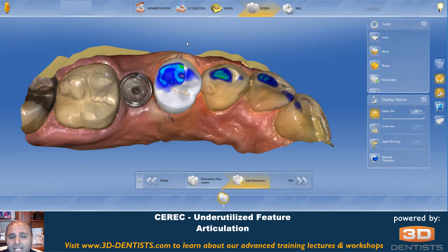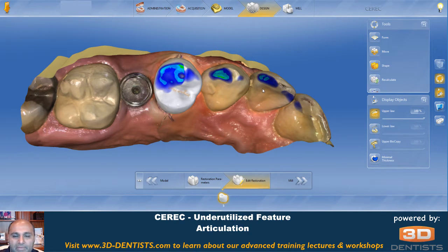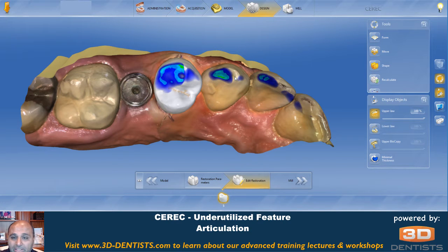A point of note: some people find that articulation is only good for multiple units or with full arch scans, and it is more predictable with full arch scans. So in a perfect world, we want to capture both canines on the upper and lower arch so that we have more data to be able to do a positive movement. Keep those things in mind — there are times when it doesn't work.